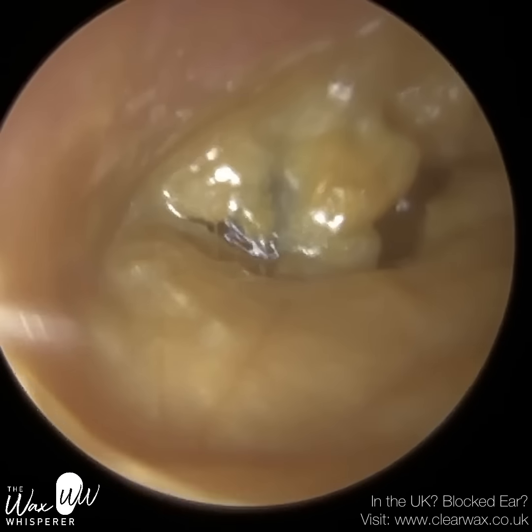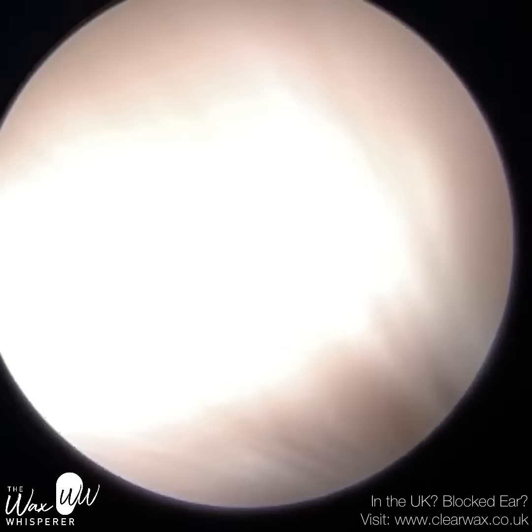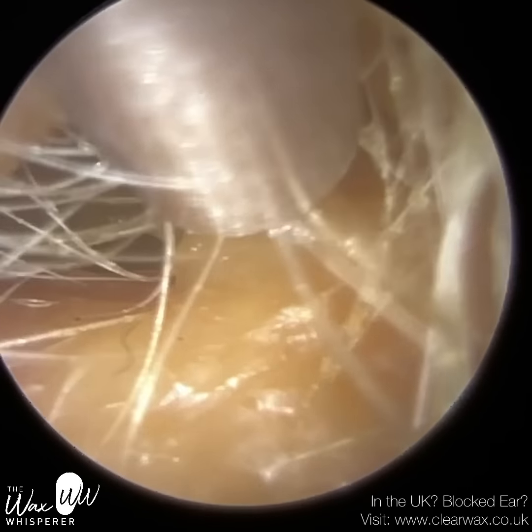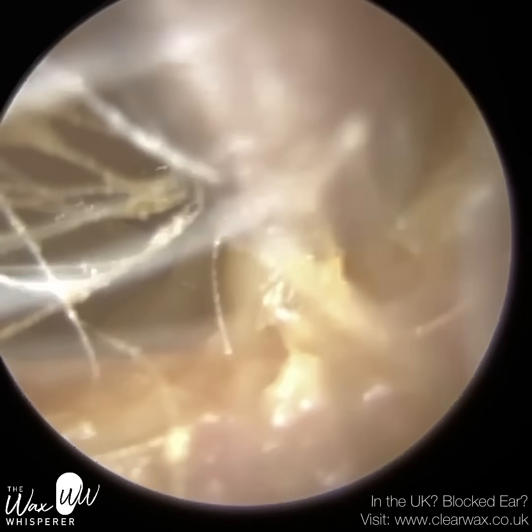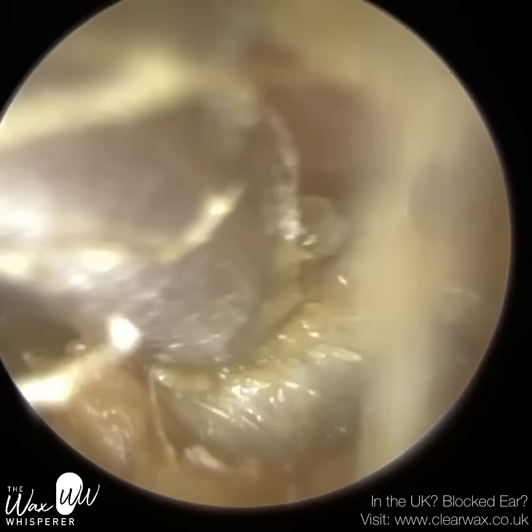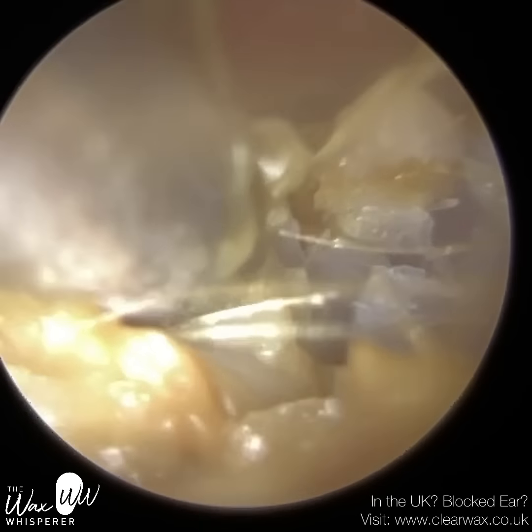This is a patient who attended with an ear infection in both of his ears. They are a hearing aid wearer, and they noticed over the last few days they weren't hearing so well, and they arranged to visit me at the clinic. We're just starting off in the patient's left ear.